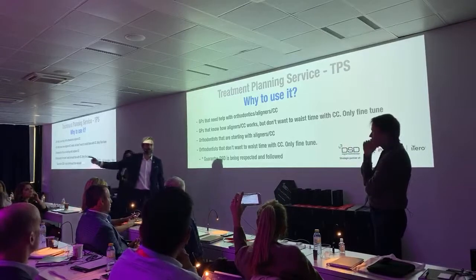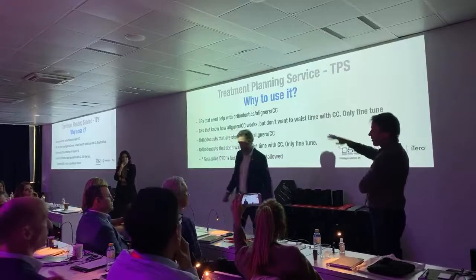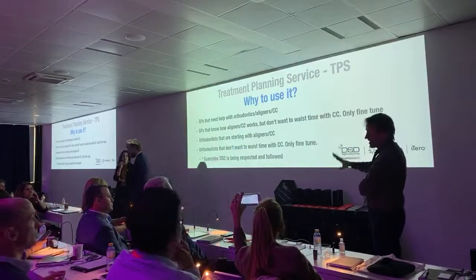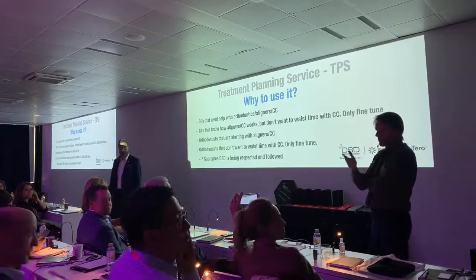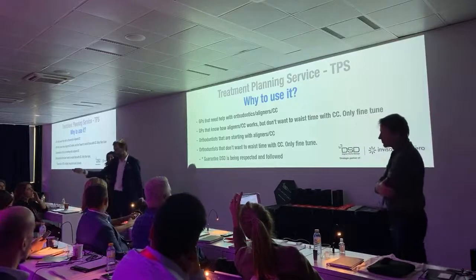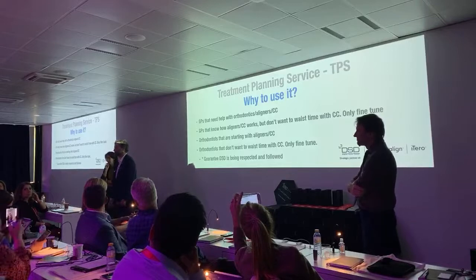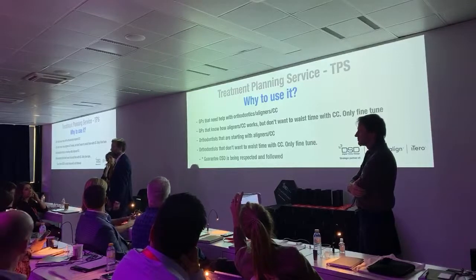He wants the orthodontist to have access to his DSD account before Invisalign, to help you understand if ortho is needed and what type of ortho. Or you can send him the presentation directly, or you give the access of your account. It's up to you. You restrict what you want them to do.